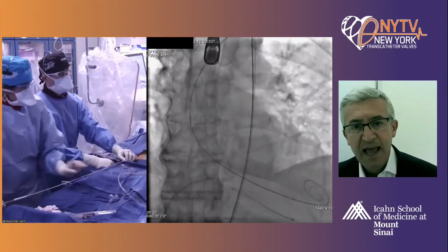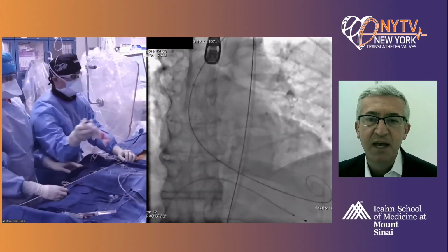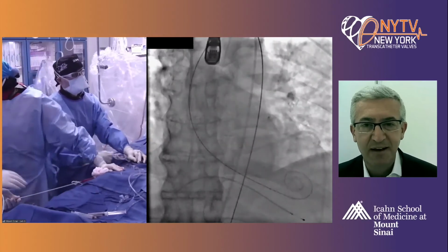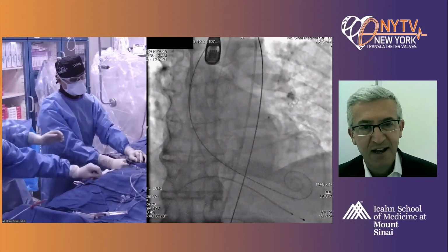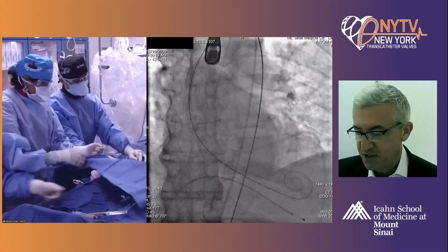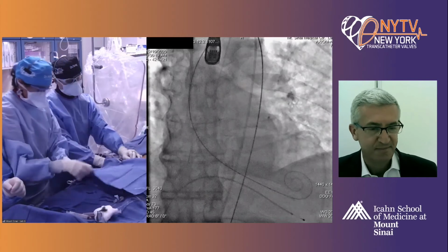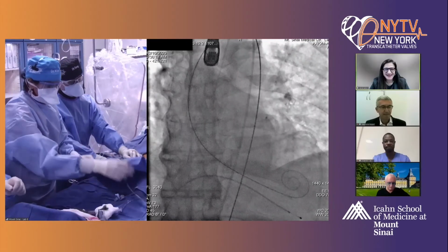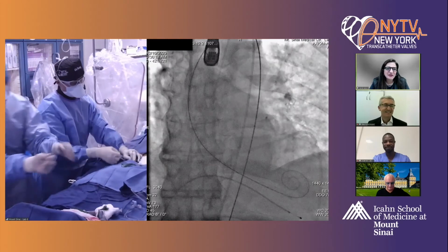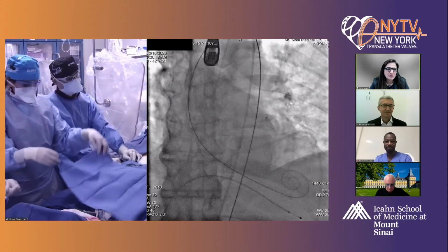And again, perhaps this would be a good candidate for Lotus. I'm sorry that they terminated, but calcified and bicuspid, it would be a good combination for Lotus. But that's okay. I think Sapien is a good choice. Oh, for Lotus, I see. Okay. All right. So any other thoughts before we go back to the main room to see what's next?